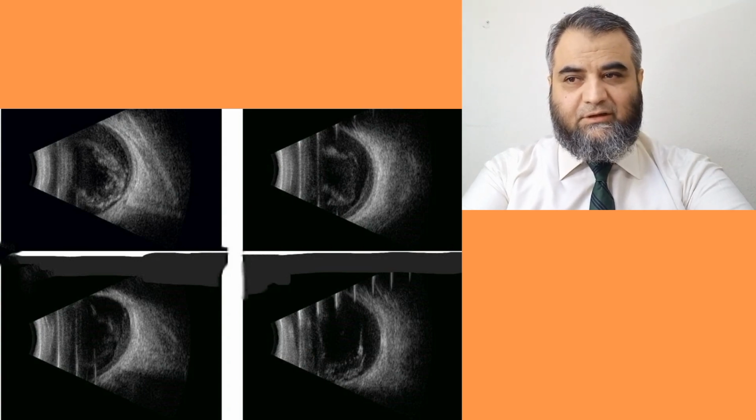Here it is clearly shown that you can see vitreous opacities, but the retina is flat, with no detachment and no traction. But vitreous haze and opacities you can see there.